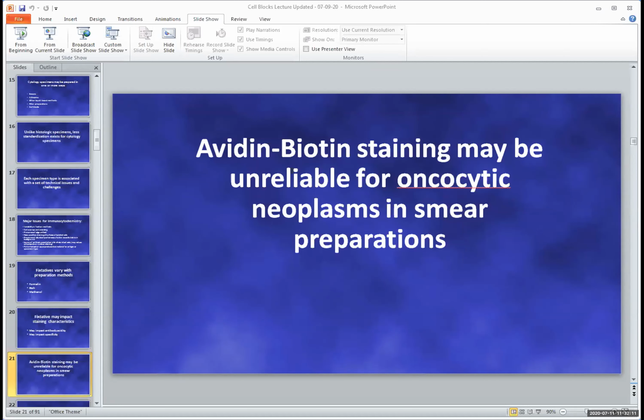The senior cytologist felt strongly that this was going to be a medullary carcinoma. They ordered a calcitonin to confirm that diagnosis, and indeed the large cells with abundant granular purple cytoplasm stained strongly with an avidin and biotin based immunocytochemistry preparation. That led the patient to have a total thyroidectomy, and unfortunately when the thyroid was examined histologically, it was a hyperplastic nodule that had a predominance of Hürthle cells in it.